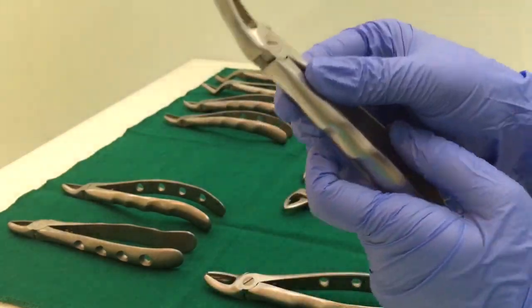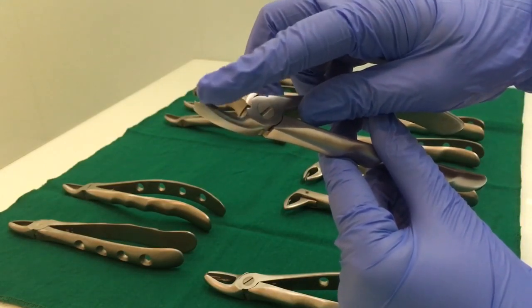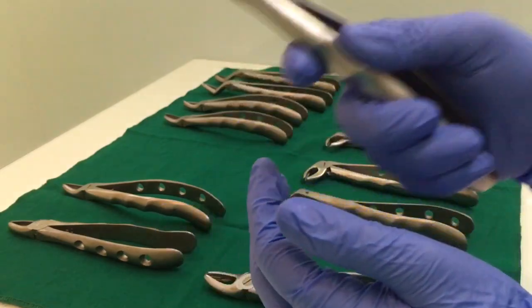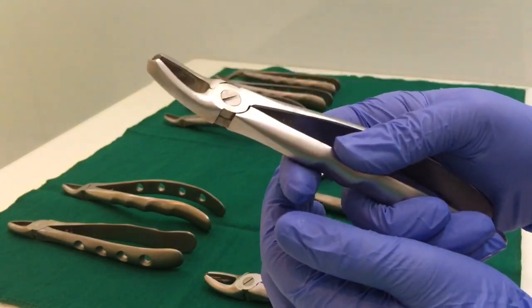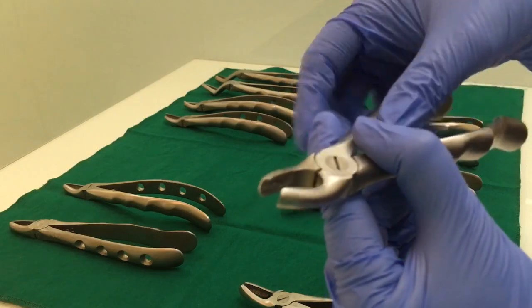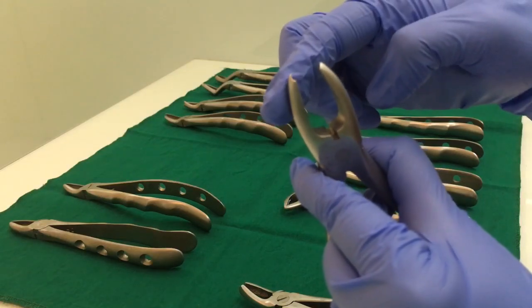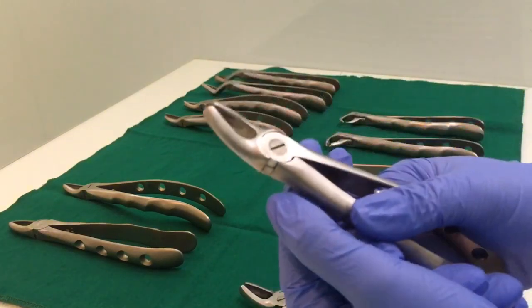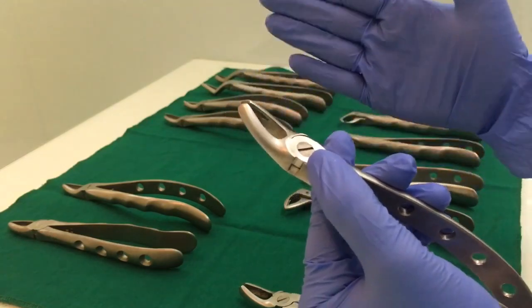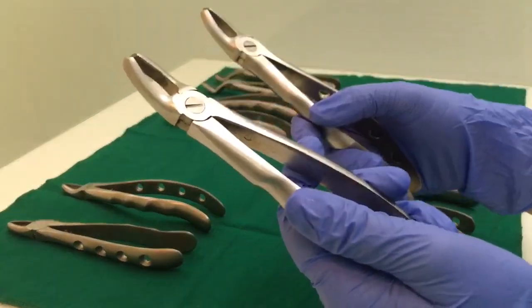If you see this one right here, it has a pointed end. This pointed end will go to the buccal side. So if you hold it like this, it comes on the buccal side of the left side of your oral arch. So this is your left side upper molar forcep, and this is your right side upper molar forcep.